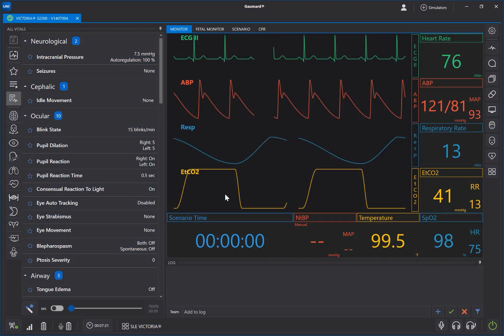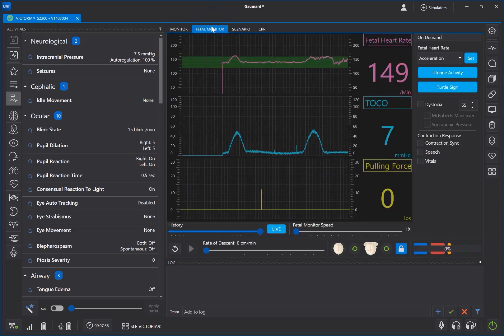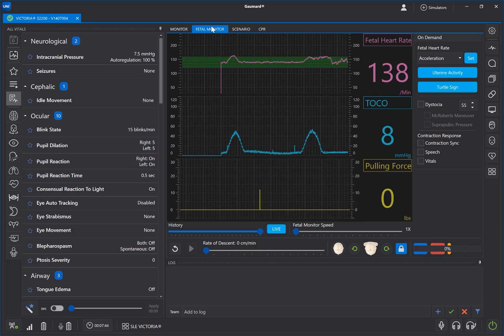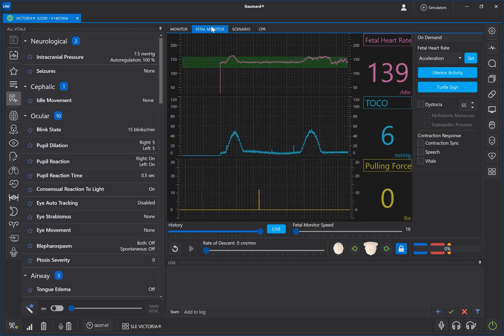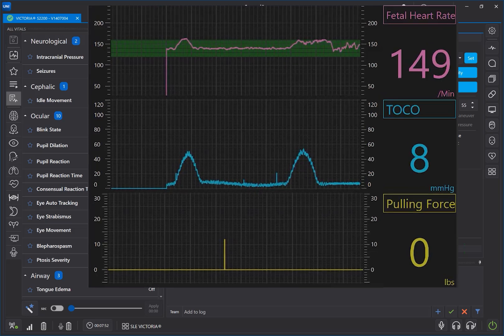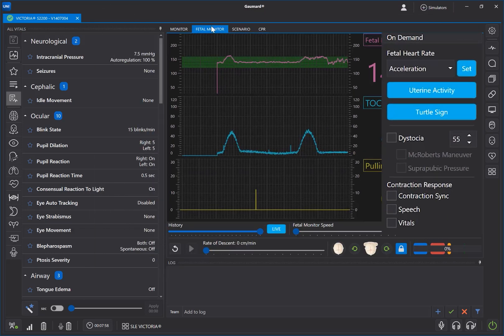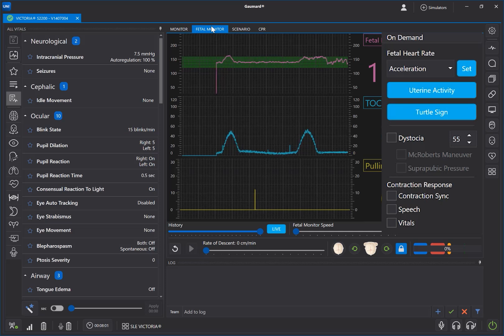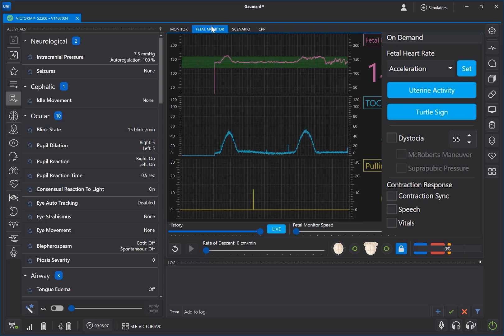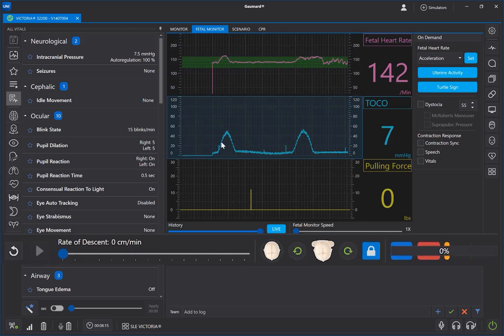To start an on-the-fly labor, click the Fetal Monitor tab at the top of the screen. This tab houses all the controls and sensors needed for on-the-fly labor. The main area displays the fetal heart rate, contractions, and pulling force detected on the head of the baby. The panel on the right can generate on-demand intrapartum activities, including fetal heart rate variations, contractions, shoulder dystocia, and realistic contraction responses. The lower panel is used to start the labor, adjust the speed of descent, configure cardinal movements, and monitor progress.